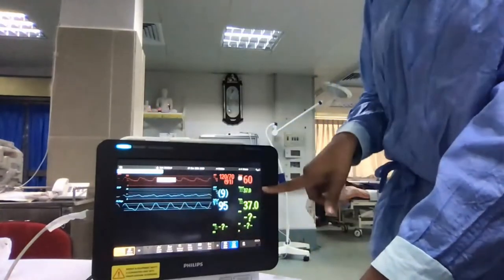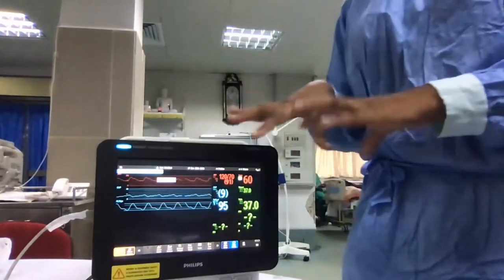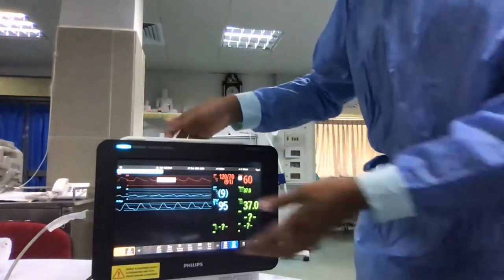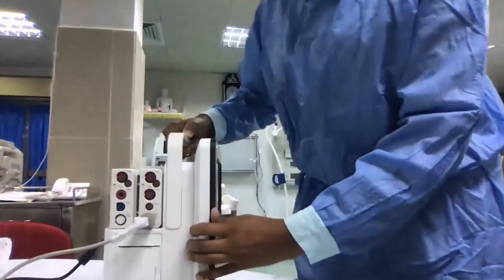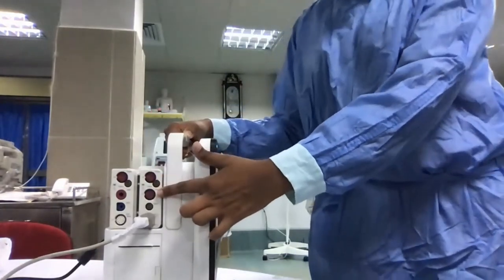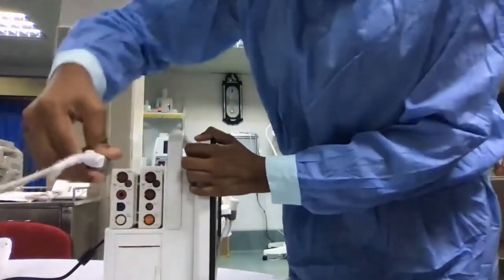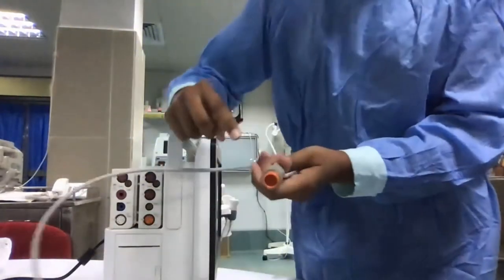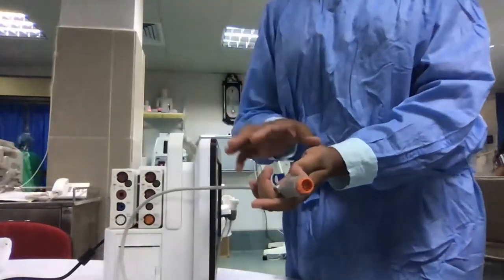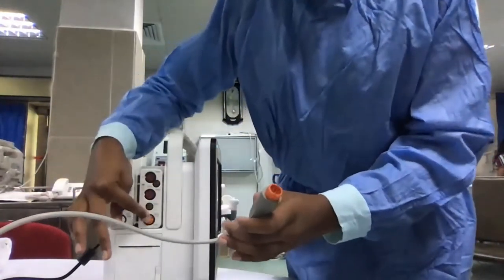So this is the PiCCO screen, but in the future we will be upgrading this system to a dedicated PiCCO screen. Like I told you earlier, we need a cardiac output extension or cardiac output module, and I will show you that port as well. The cardiac output cable and port are always orange in color. Like I told you, madam, everything is color-coded, so you won't get confused. So this is the cardiac output port.